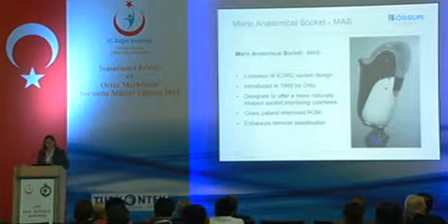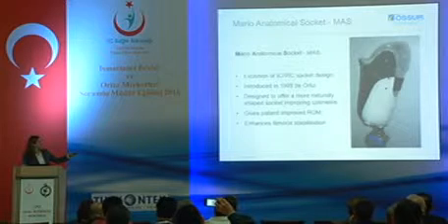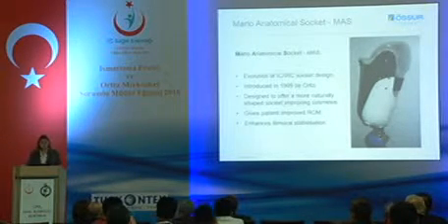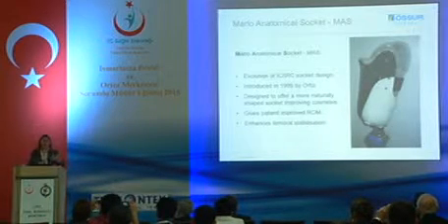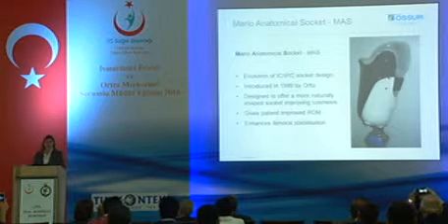So, as the design evolved, the containment, instead of being more in a posterior place, started to become more medial. And actually have the ischium free. So the amputee would sit down on his own ischium rather than on the socket.